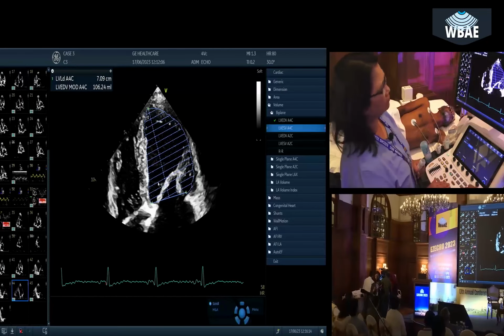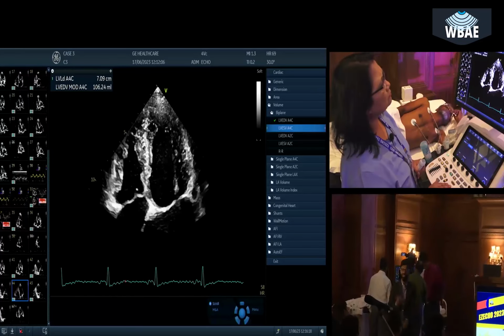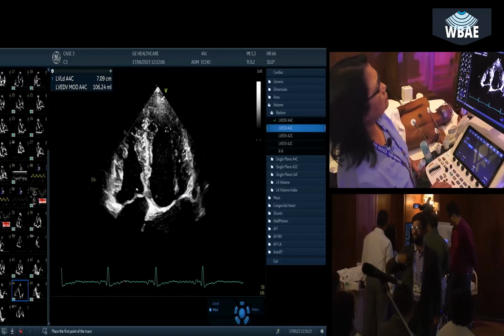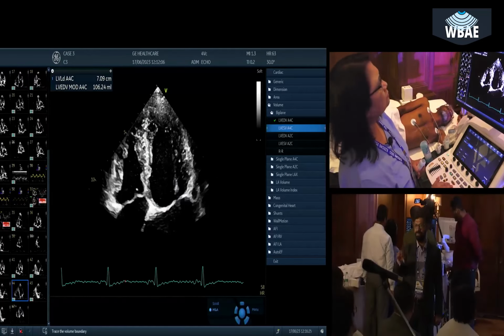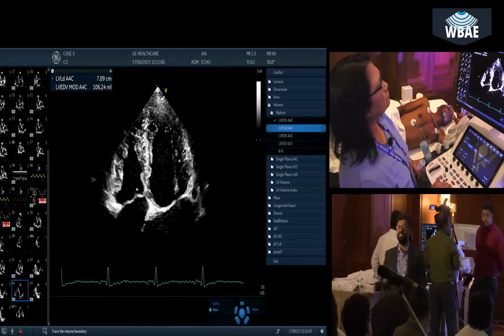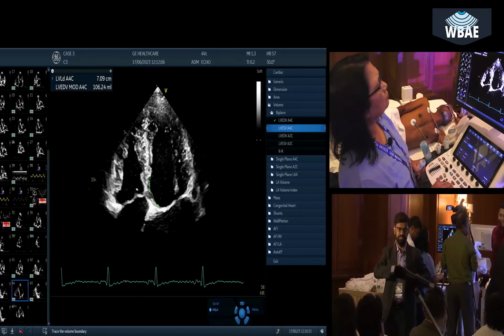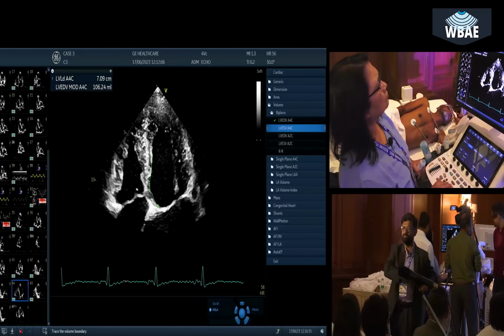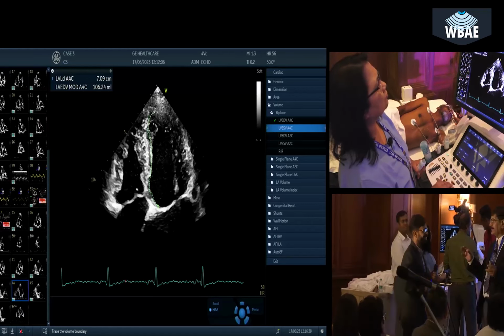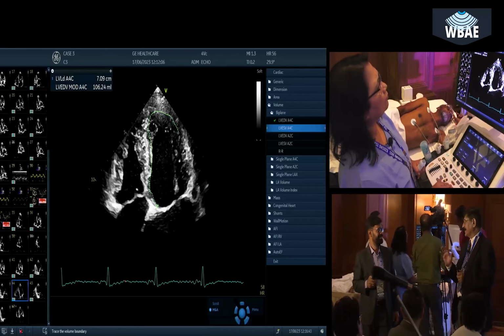What I am trying to tell you is that I put 3 ECG leads and use them on 10 patients. But I put them. It is very important. So this is the off-label thing. If you want to save money, that is one thing. Second, the usage of jelly on the probe should be very minimal because it slips. I think you should buy the electrodes cheaper and use them. I never use them a second time.